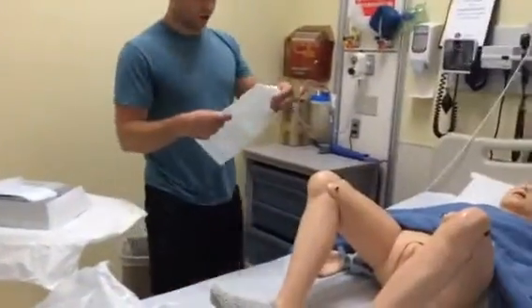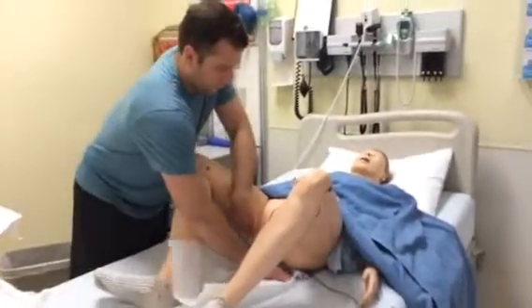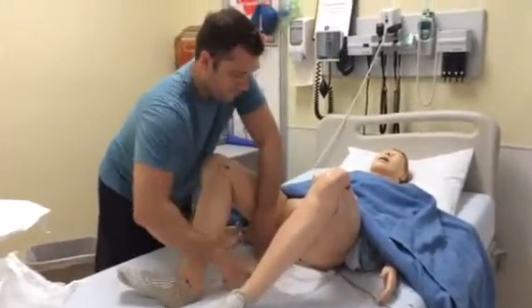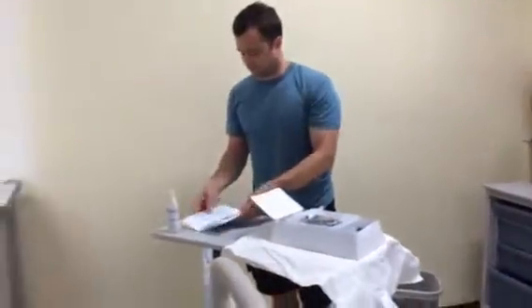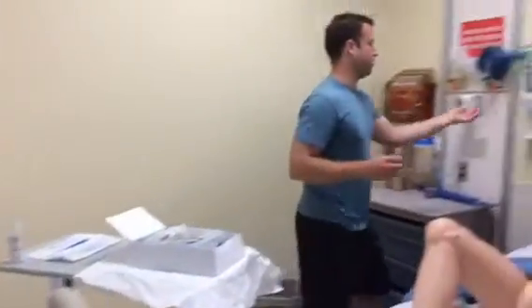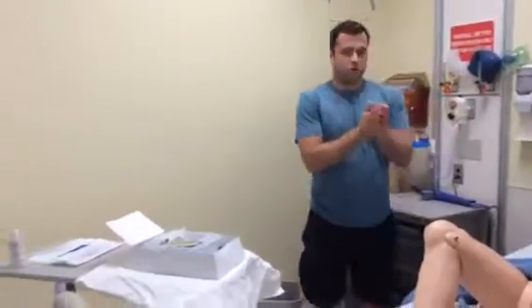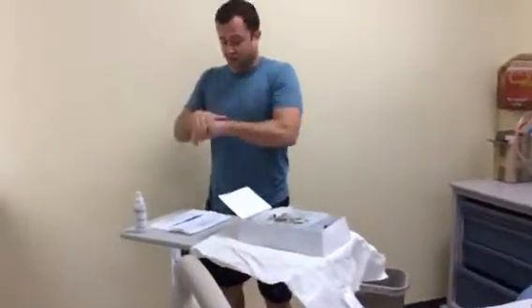Put this pad underneath your bum. Just lift up your hips a little bit for me. Thank you. And now I'll go ahead and put on my sterile gloves. I'm going to do hand hygiene first. And I'm going to make sure they're nice and dry this time because I broke my sterile gloves last time.